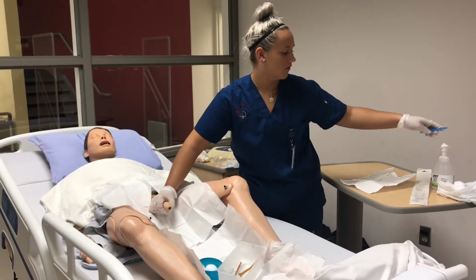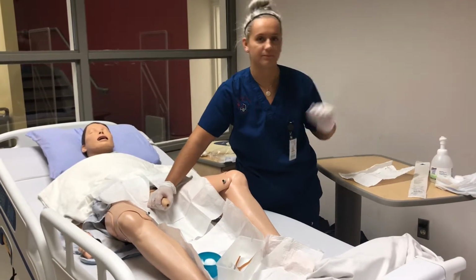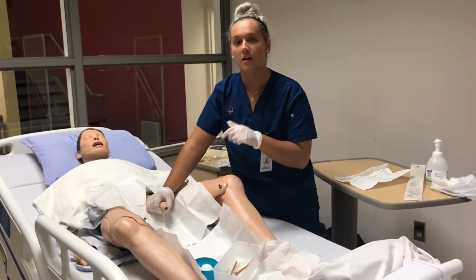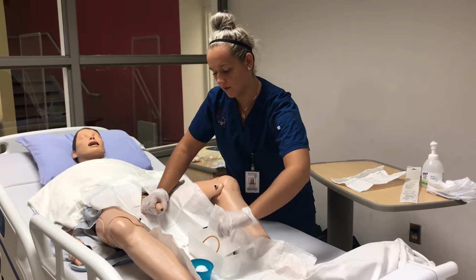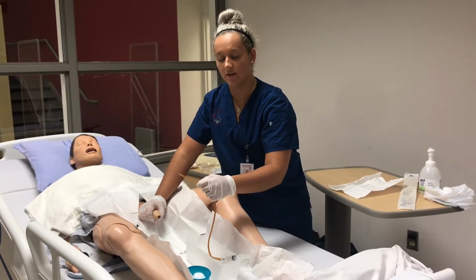Okay, so since we don't need these anymore, these can also be discarded. Okay, so now the catheter is ready for insertion. Again, you're going to want to keep your non-dominant hand, that's already lost sterility, on the shaft of the penis. Then you're going to want to hold the catheter about 3 inches away from the tip.